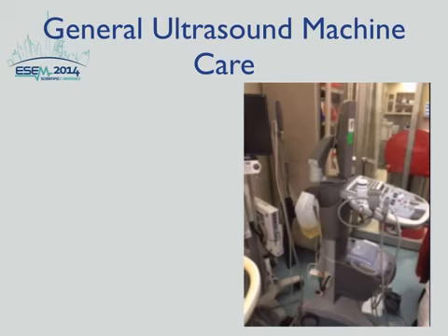I'll give you a second to let me know what is wrong with this picture. This is an ultrasound machine that has a urinal hanging on it. This is one of the pictures that was taken by my colleague Scott Glazier, and he emailed us all to let us know he was extremely mad because we did not take good care of the ultrasound machines.